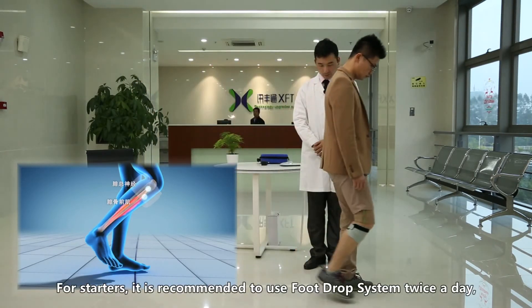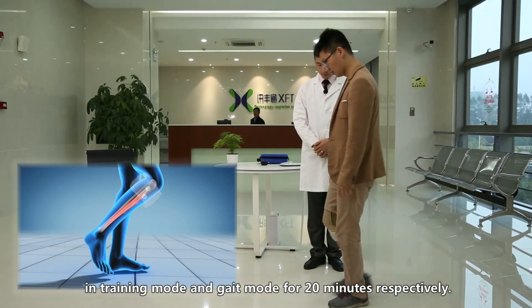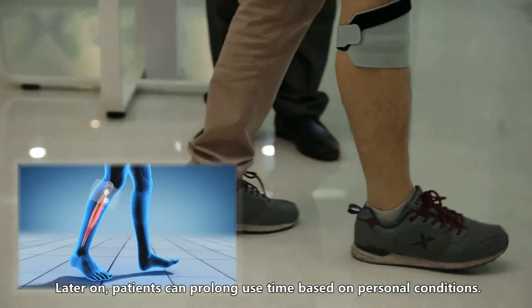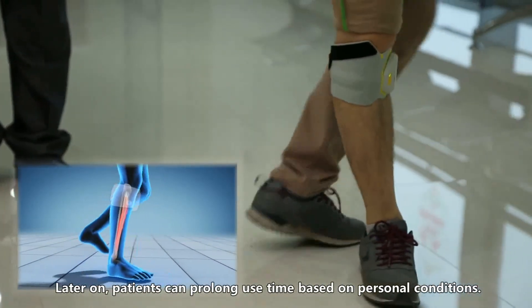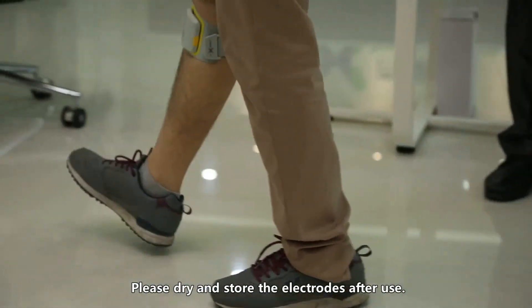For starters, it is recommended to use the foot drop system twice a day in training mode and gait mode for 20 minutes respectively. Later on, patients can prolong use time based on personal conditions. Please dry and store the electrodes after use.